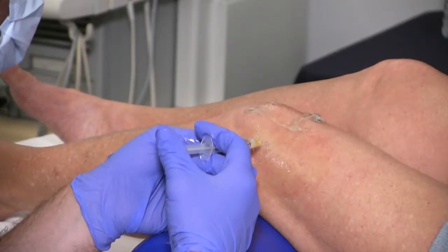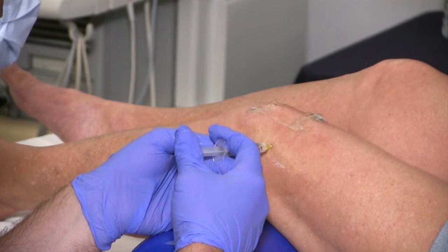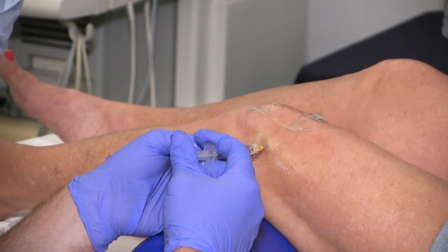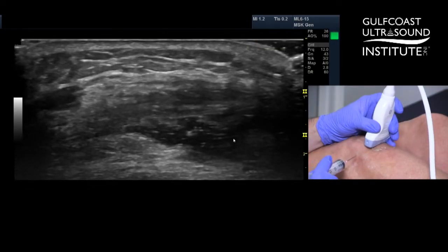This is just lidocaine — we're just going to numb the area. This is just a 30-gauge, half-inch needle. I'll punch it through all the way to the retinaculum and try to numb the retinaculum as well. We'll give that just a second, because we use an 18-gauge needle to do this. All right, big push here.